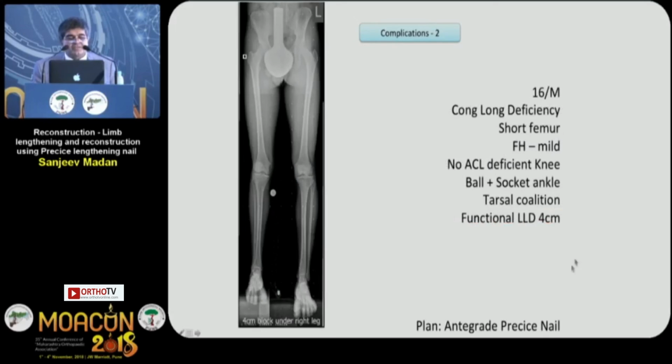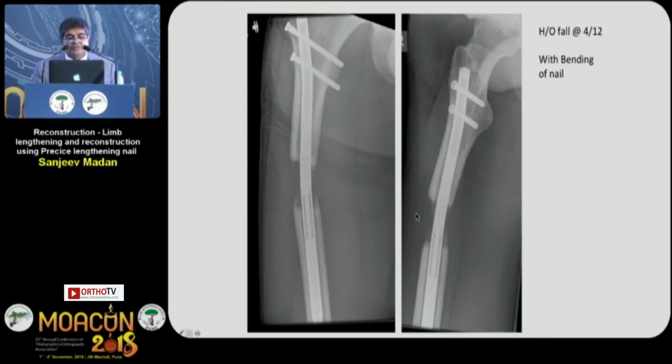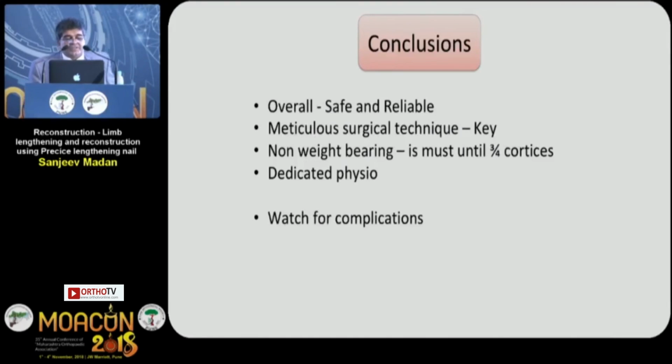And so this other complication was in the antegrade nailing, no ACL, ball and socket ankle joint, and the nail started bending in this case, you see. And therefore we had to stop the lengthening and put in a revised trauma nail, and then finally the patient went on to consolidate. So it's a safe and reliable procedure.